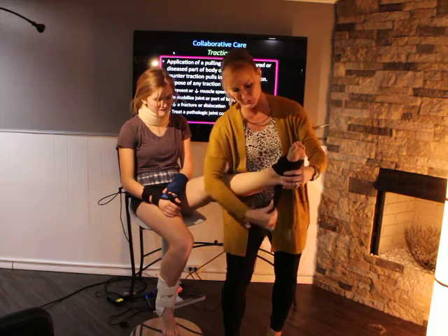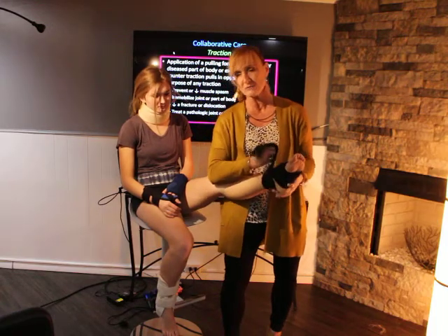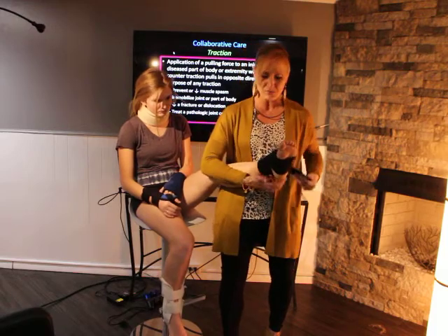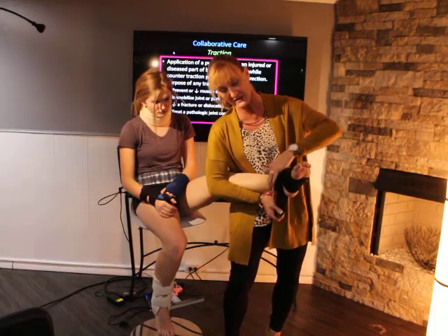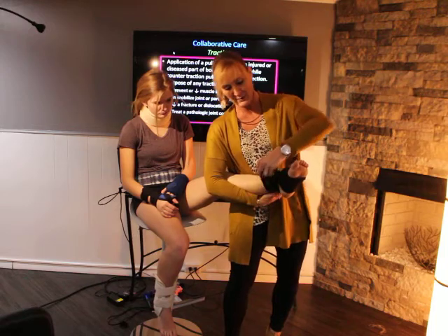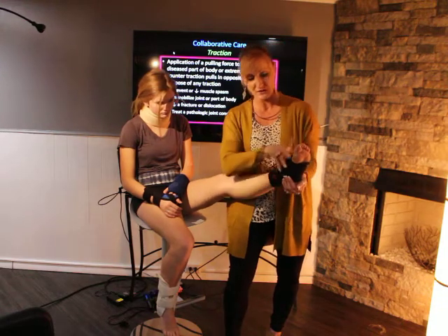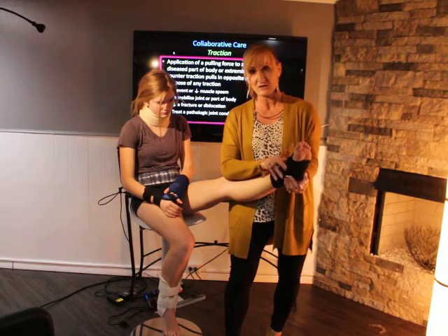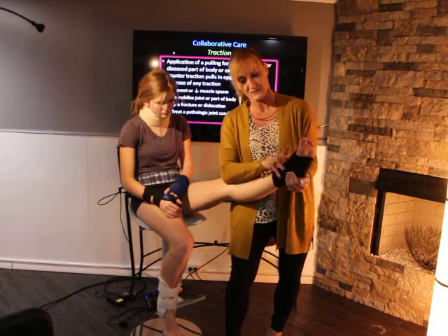What you're going to want to do is support the injury. So you're not really trying to immobilize it as much as you would if your patient had a broken bone, but you're just wanting to offer it enough support. And see how you're twisting it and you're layering it on top of each other, causing the fluid to shift this way. You're going to wrap it up and around, tighten it on itself. And what this does is it feels really good on your patient who has trauma, because it's going to be painful. Feels really good, keeps the swelling down, the inflammation down, and it helps just offer some support while this joint is healing.